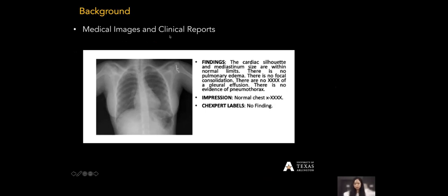Besides extracting the labels from the clinical notes and using them to supervise image tasks like segmentation and image classification, we are also currently working on medical image captioning, like the automatic generation of medical reports from radiology images. So far, we're first starting with chest X-ray. Basically, the input is a chest X-ray image, and the output will be the clinic notes. Here's one example that shows a chest X-ray and its clinic notes.